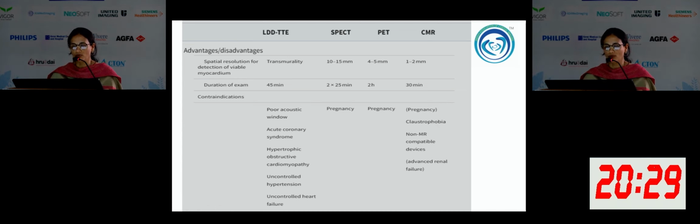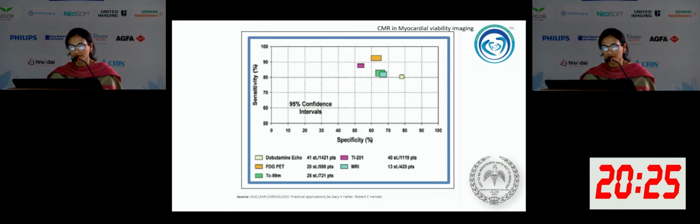We'll come into that also, what we can do in those situations. Coming to the sensitivity, specificity, etc. So MRI is quite similar to SPECT, and the specificity of dobutamine echo is better, whereas the sensitivity of FDG PET is better.